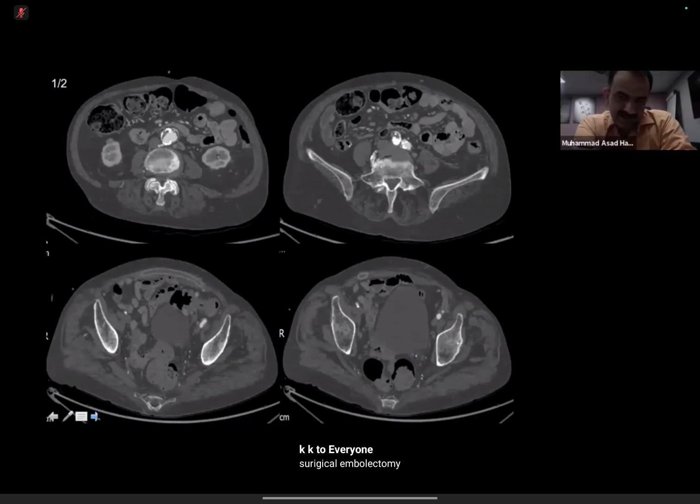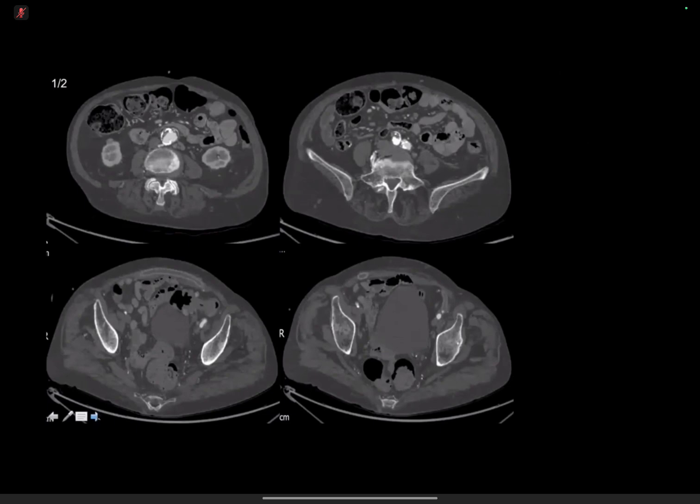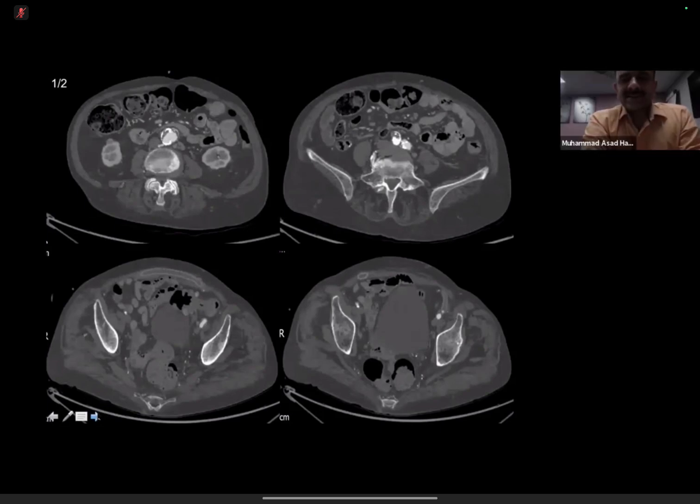Are there any other additional findings? Yes, there is. I think a fem bypass. Good. Bypass graft. Yes. For the other candidates, can you see my arrow there?